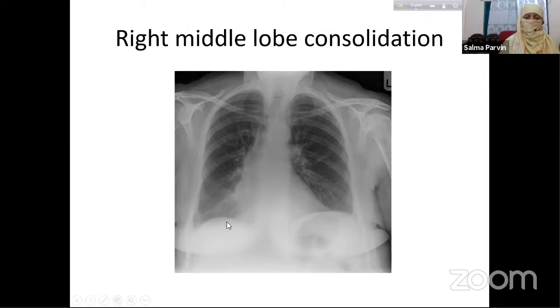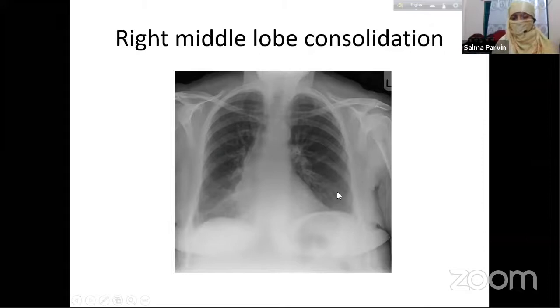I cannot see well. This part of this lung is really obscuring the lateral border of the heart. It is obscuring, at least producing some haze, so that you cannot trace the right border of the cardiac shadow. So something else is present here, obscuring the right border of the cardiac shadow. And a haze is produced here so that you cannot see the normal alveolar blackness present in the other parts of the lungs. Yes, and you may say that there is haze seen in the opposite side of the lungs.